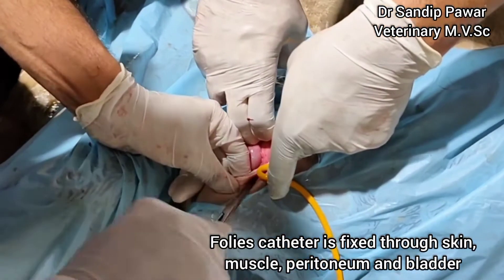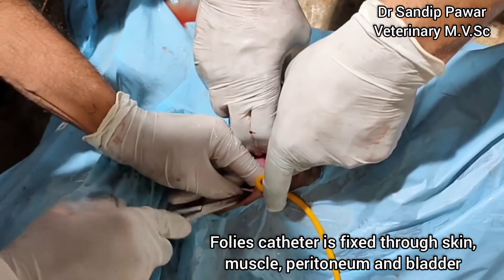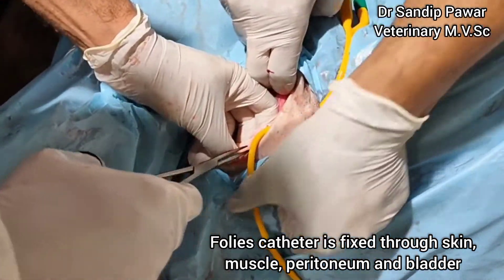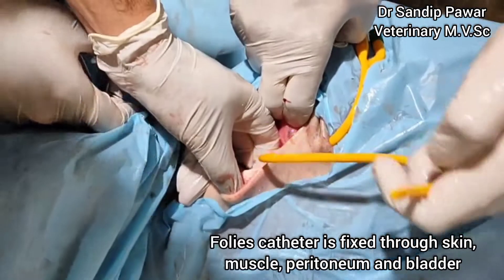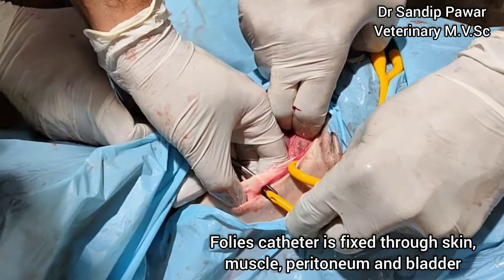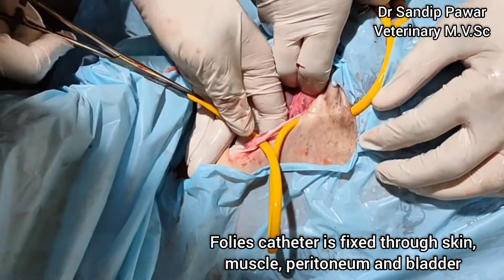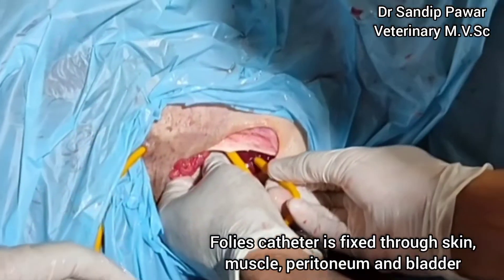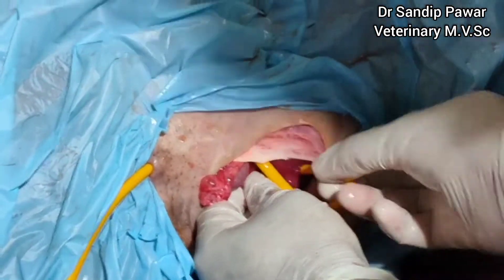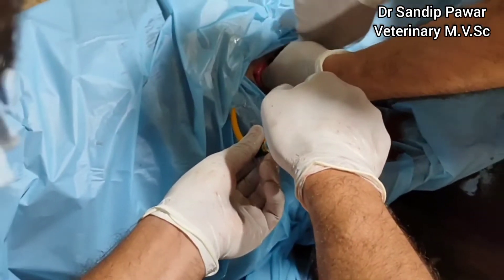After that, Foley's catheter is fixed through skin, muscles, peritoneum, and urinary bladder. The Foley's catheter was fixed through the urinary bladder by ballooning, which was achieved by passing air via syringe.